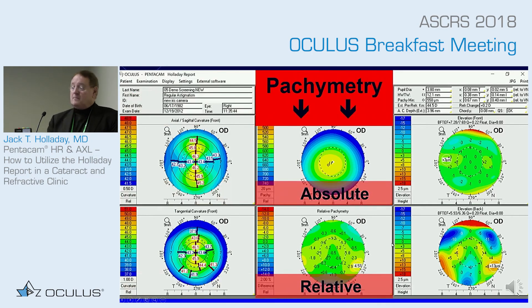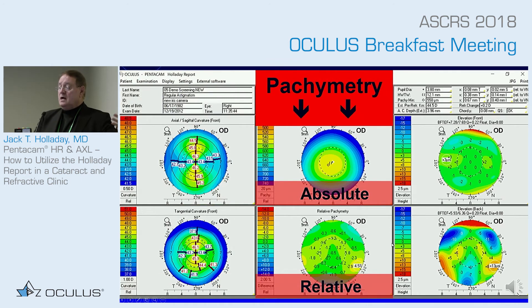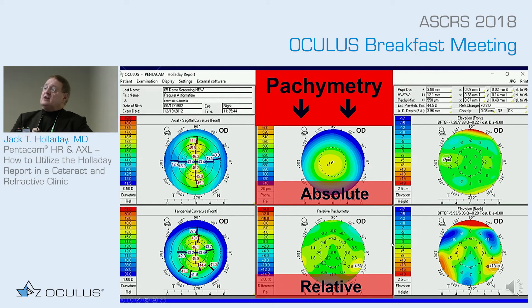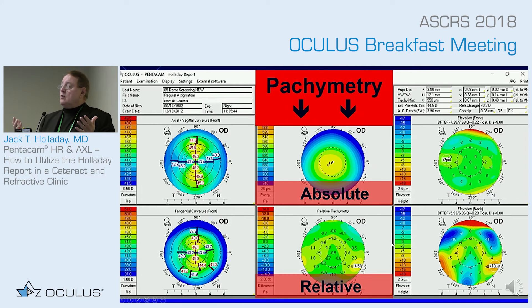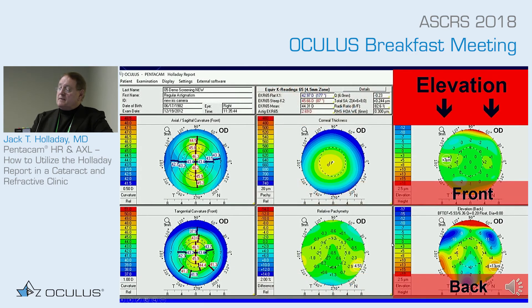The second column is pachymetry. The normal pachymetry map on top always shows the thinnest point in the center — marked by the black circle — and gets thicker toward the periphery, because it's a negative meniscus lens. The relative pachymetry map gives the percentage thicker or thinner than normal at every location. Values of minus 1.4, minus 2, minus 0.5 percent — plus or minus a couple percent is normal. This is very helpful in keratoconus and post-refractive surgery evaluation.